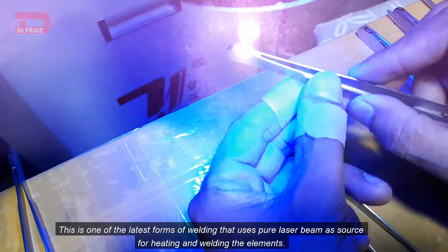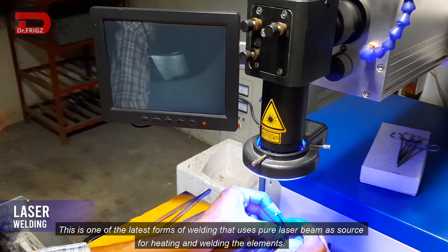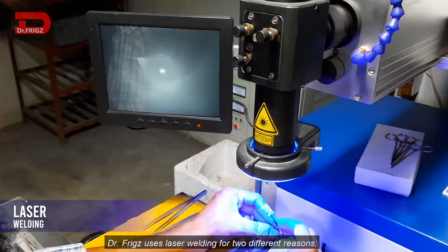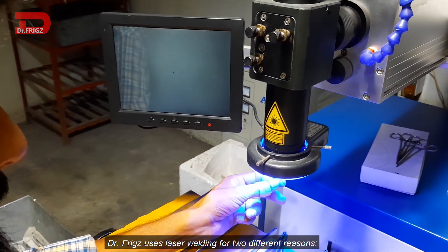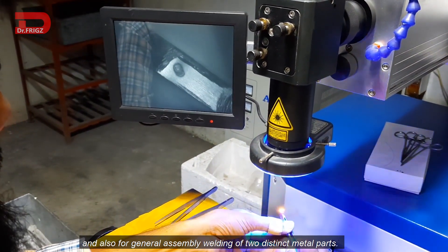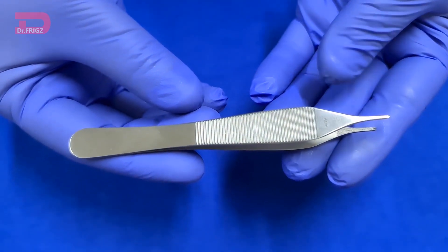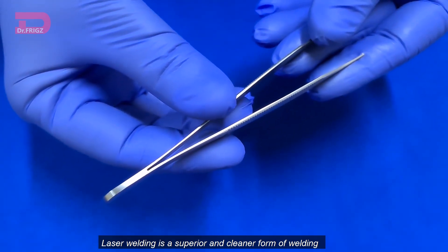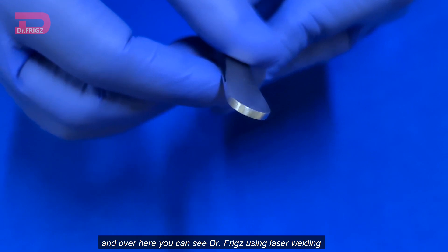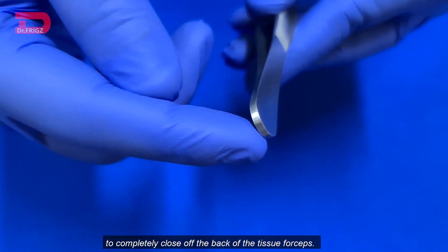Laser welding. This is one of the latest forms of welding that uses a pure laser beam as a source for heating and welding the elements. Dr. Frigz uses laser welding for two different reasons: for repair purposes of instruments and also for general assembly welding of two distinct metal parts. Laser welding is a superior and cleaner form of welding. Here you can see Dr. Frigz uses laser welding to completely close off the back of the tissue forceps.